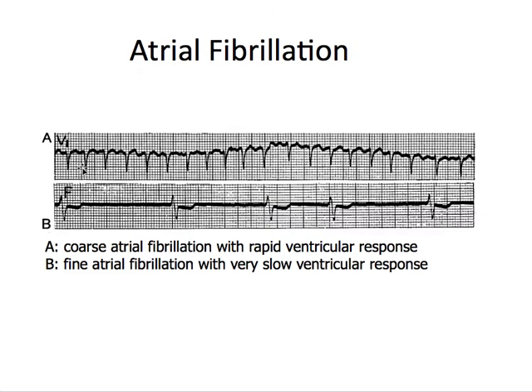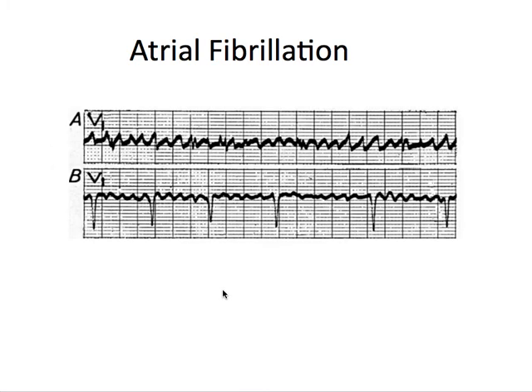Here's another one — this is coarse AFib with RVR; the rate is about 150 to 200. The bottom here is fine AFib with a slow ventricular response. This top one is actually AFlutter and the bottom one is AFib, so it's really subtle to look between the two. You can tell the AFlutter is more of a pointy, sawtooth shape — this would hurt if it went over your skin — whereas down here it's kind of a bumpy surface; it wouldn't cut you.